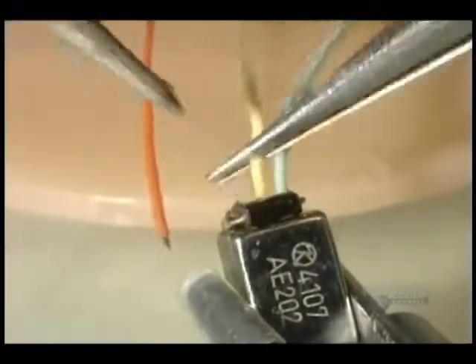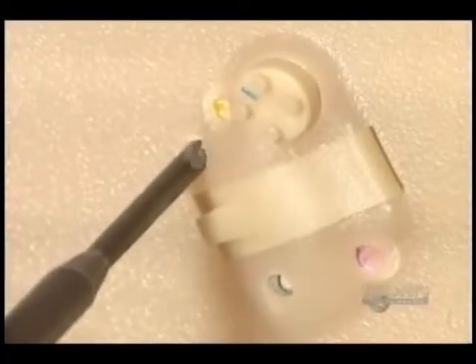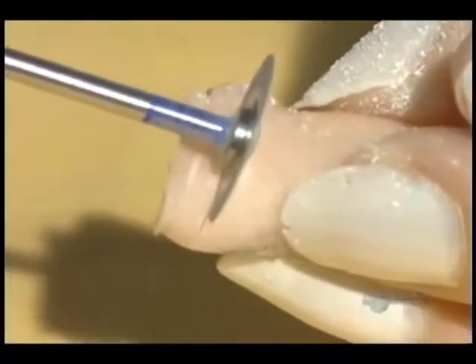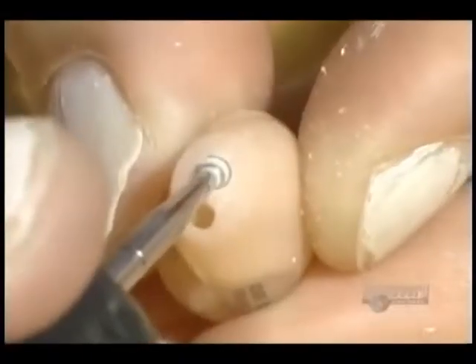The wires are soldered to the speaker, and they verify the proper functioning of the volume control. A hearing aid must be very discreet, so the excess is cut with a diamond disc and the roughness is removed with fine sandpaper.